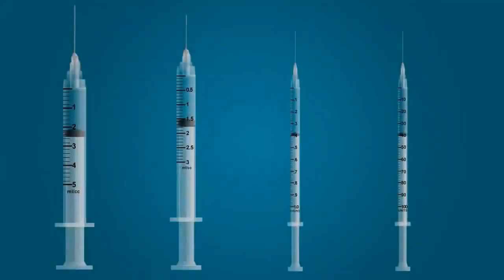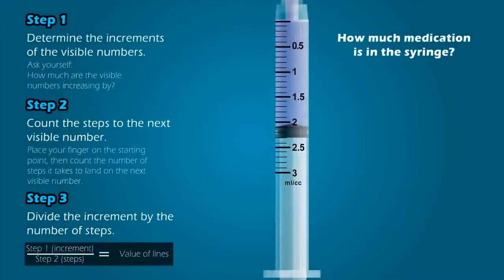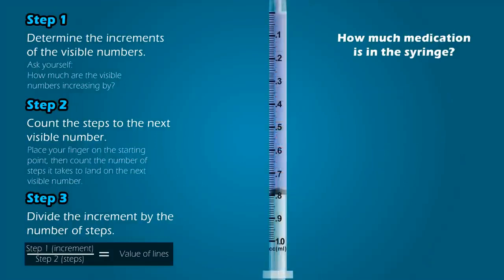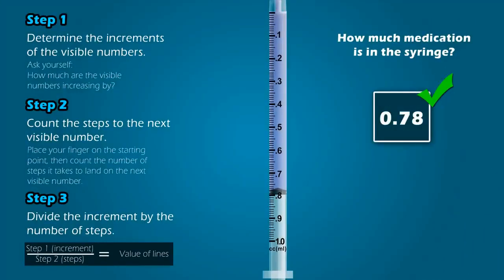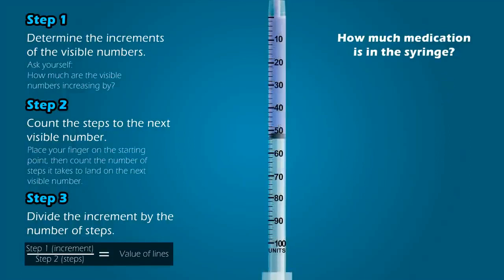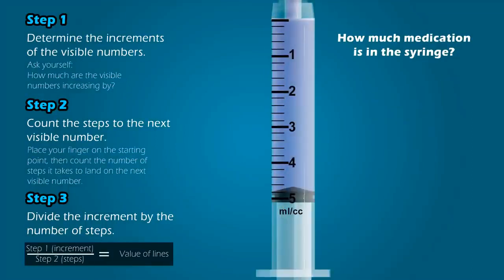We went through all of the syringes, but before I end this lesson, I want to test your skills with a few random syringes. Once the syringe appears on your screen, press pause to figure out the answer and then press play when you're ready to view the answer. Let's begin. How much medication is in this 3 milliliter syringe? How much medication is in this 1 milliliter syringe? How much medication is in this U100 syringe? And how much medication is in this 5 milliliter syringe? So did you answer all of them correctly? Great job!